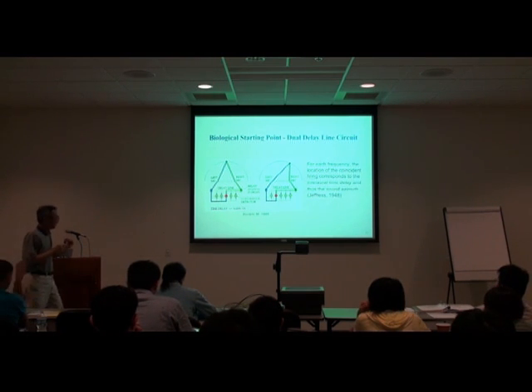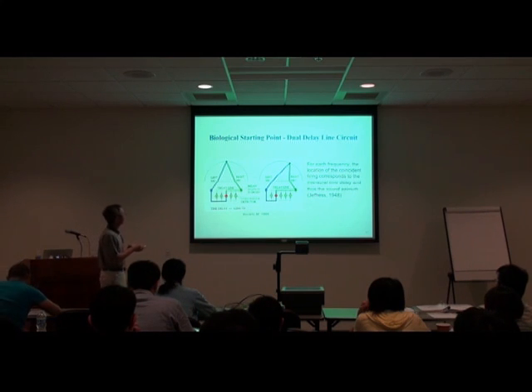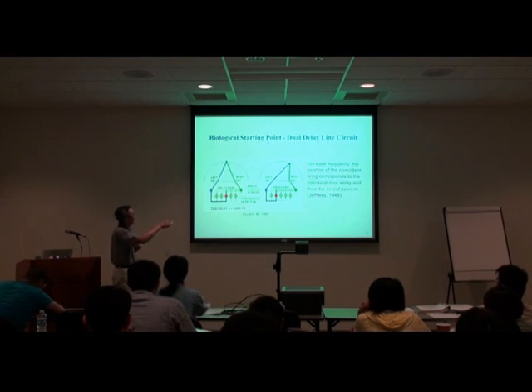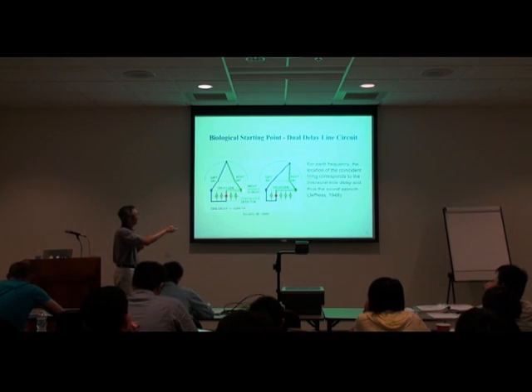So let me illustrate the process that's taking place here. Let's say there's a sound coming from straight ahead. A signal from here is going to arrive at the 2 ears simultaneously, at the same time. And therefore, when this signal is transmitted to the next station, it is going to traverse to somewhere in the middle of this dual delay line.